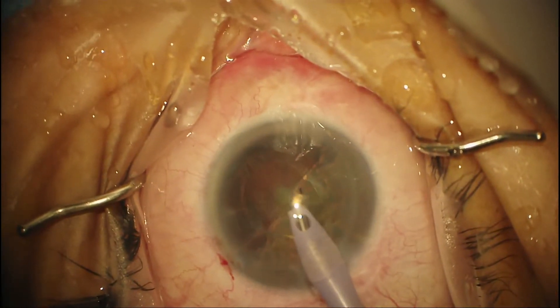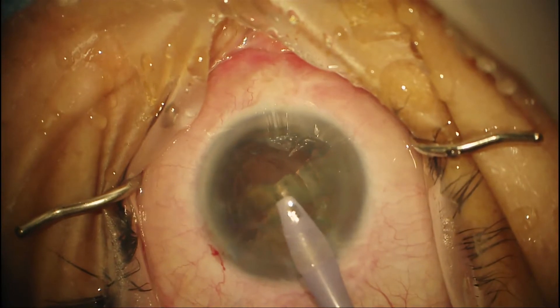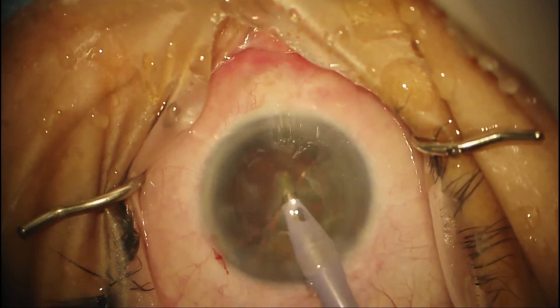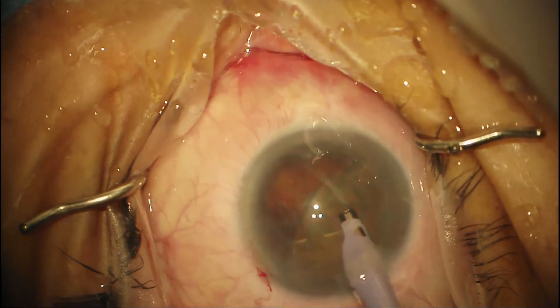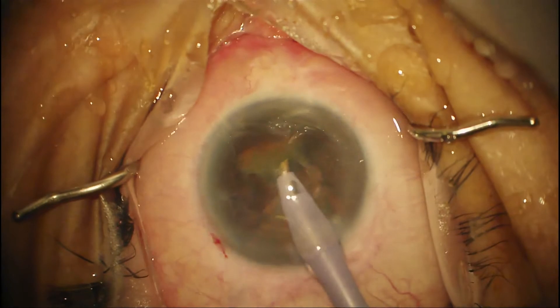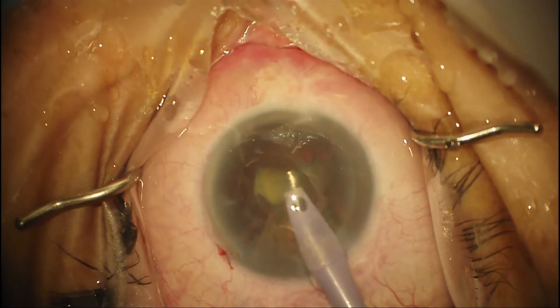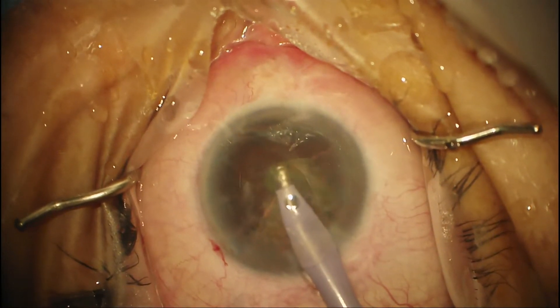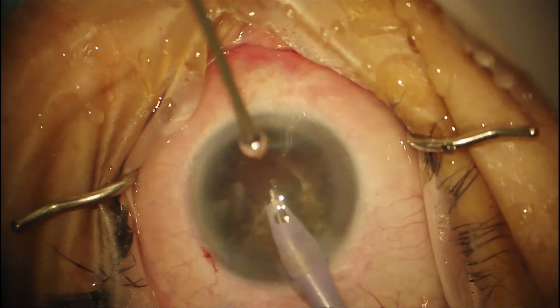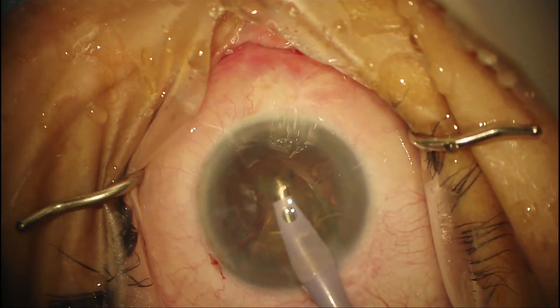People talk about the different phaco techniques — you can do stop and chop, etc. — and I think you'll find the one that works with your technique. After 10 years of private practice, I still do the divide and conquer, and can also sometimes leave the final hemi-nucleus in place and chop it in the AC. Any way you slice it, the case doesn't take more than about 8 to 10 minutes.